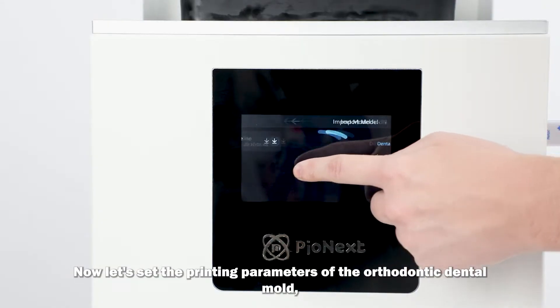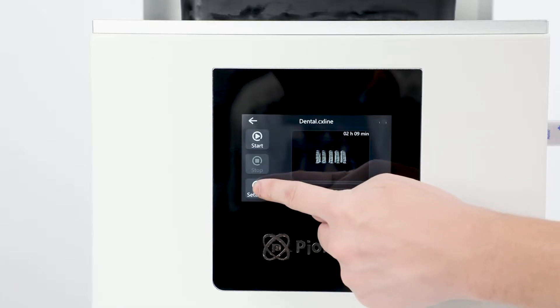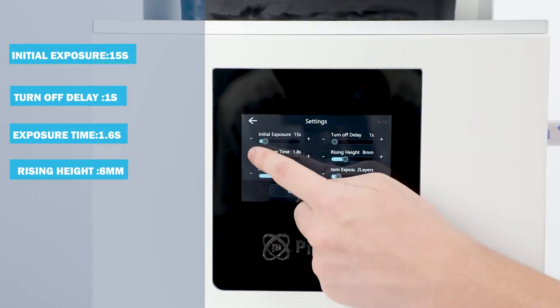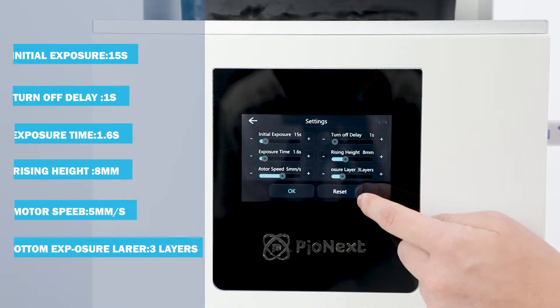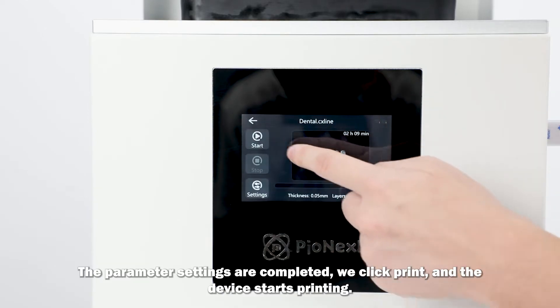Now let's set the printing parameters of the orthodontic dental mold. Initial exposure 15s, turn off delay 1s, exposure time 1.6s, rising height 8mm, motor speed 5mm per second, bottom exposure layers are three layers. The parameter settings are completed, we click print, and the device starts printing.